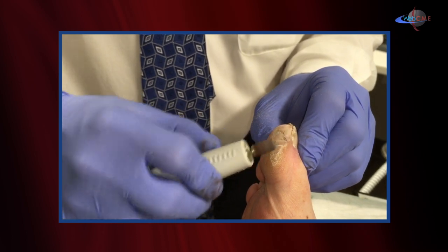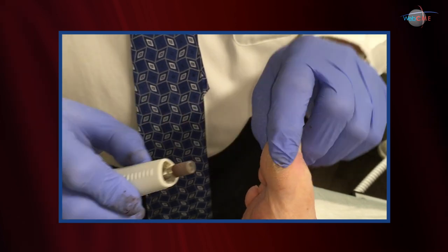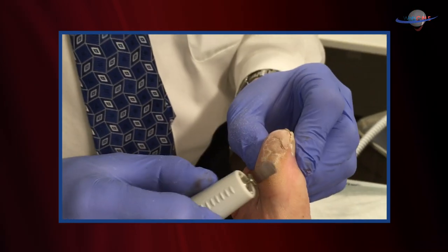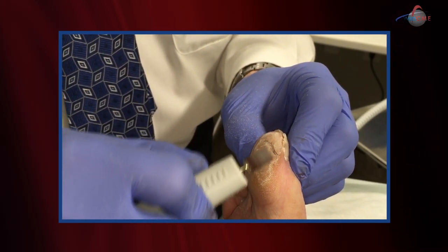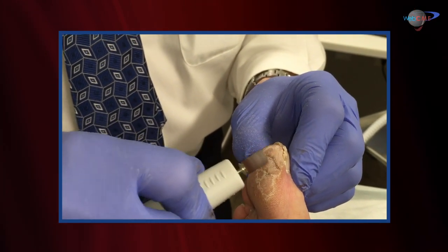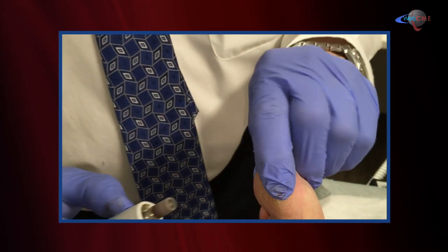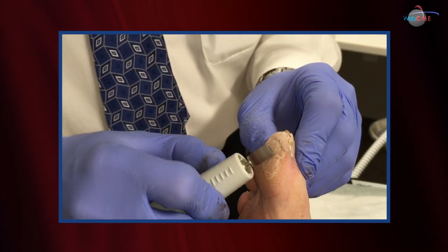Sometimes it's hard to gauge the depth of the callus. I find that by actually just feeling it with my finger, I can gauge when it becomes as soft as the rest of the skin — still quite firm, so keep going a little bit. The Dremel will heat the tissue, so you also have to monitor that. You don't want to be too aggressive, go too long, or use too much pressure, because that'll heat the tissues and cause thermal injury. Short little bursts of the Dremel, though, are very safe.